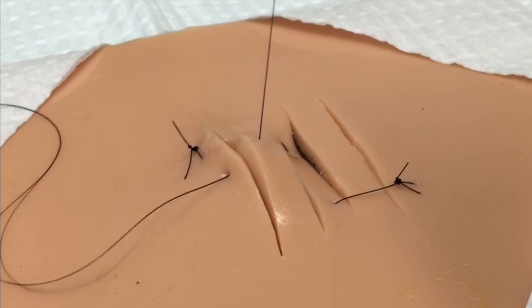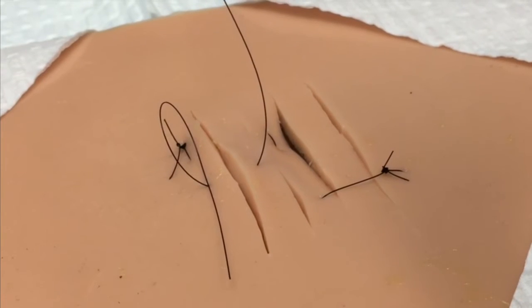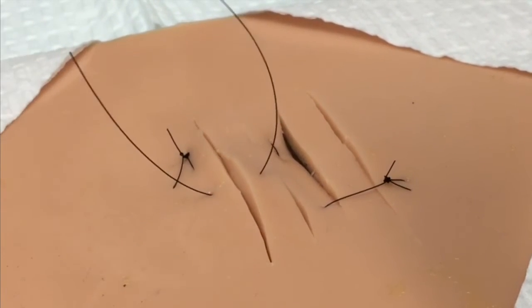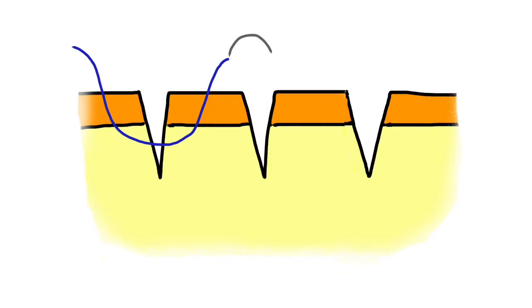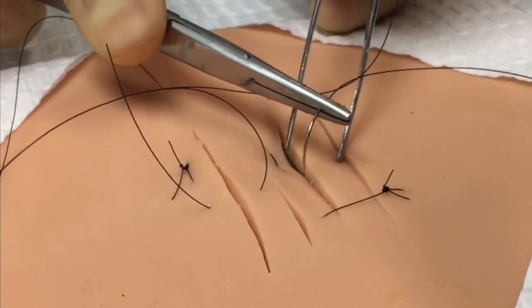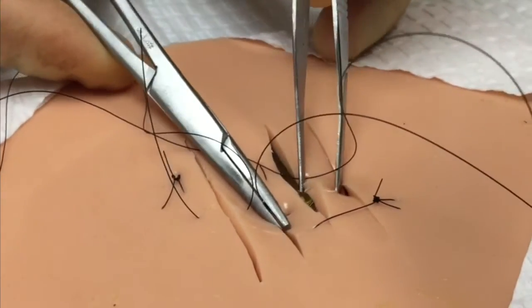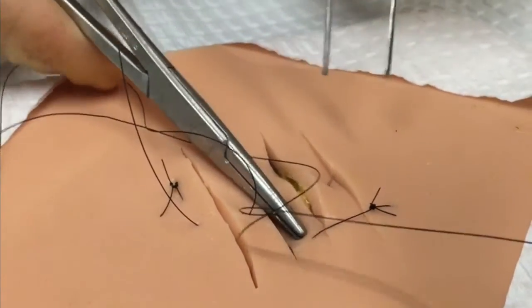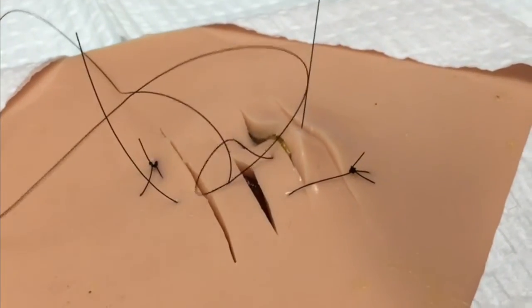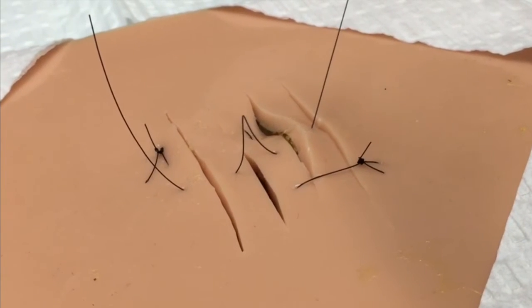Different than with the other techniques, you are then going to continue in a parallel line through the next tissue island, basically bridging the next laceration by placing a suture through the epidermis, and again out through the dermis, and up out of the next intervening tissue island. By repeating this pattern, you can close not just one or two, but several parallel lacerations, as long as they are relatively symmetric and have relatively similar sizes of the intervening tissue islands.